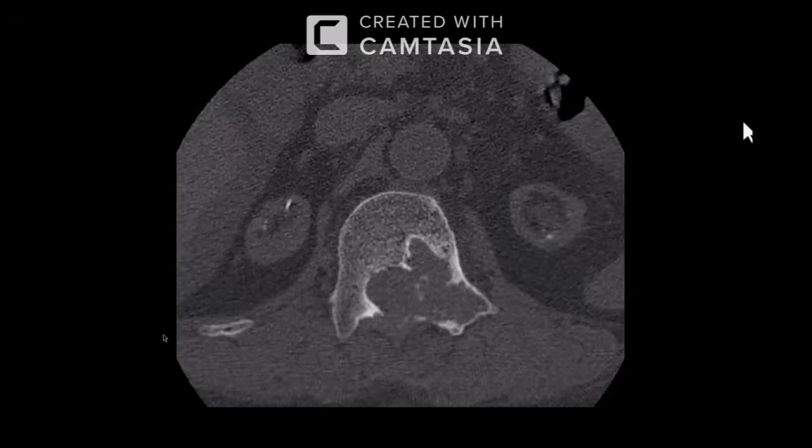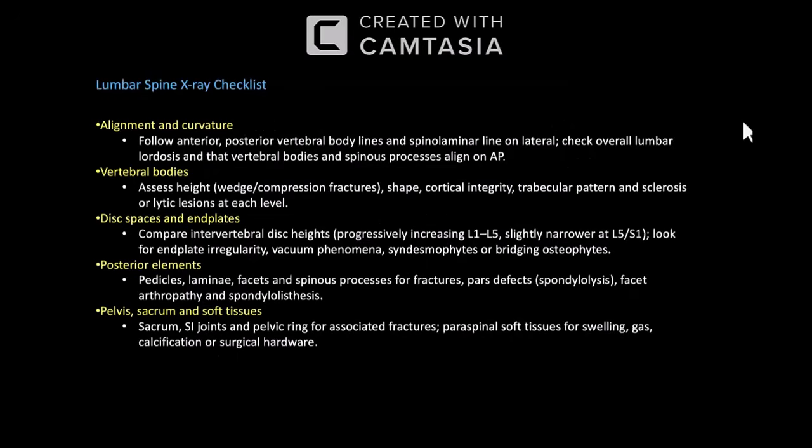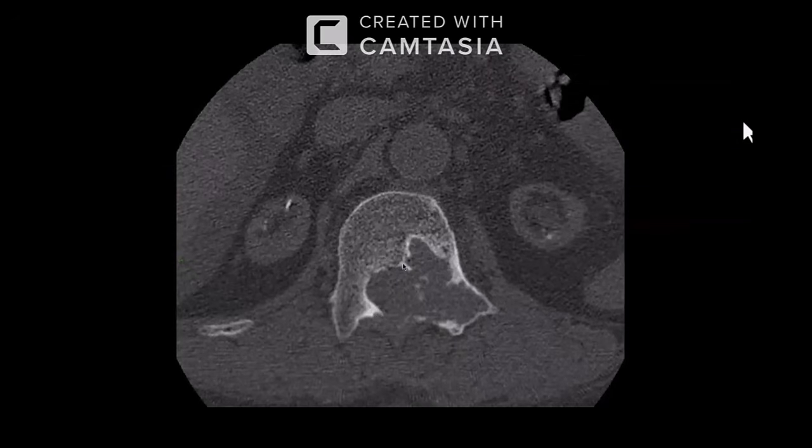Okay, sir. So this case turned out to be a Brown's tumor. So again, you should keep some other benign etiology also in your differentials. How about aneurysmal bone cyst? That can also be one of the possible differentials. Yes, sir. Myeloma, I'm not very convinced with this as your first differential. So be very cautious in the exam. All right. Yes, sir.